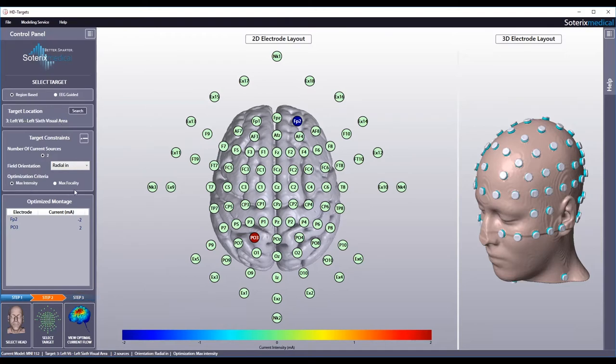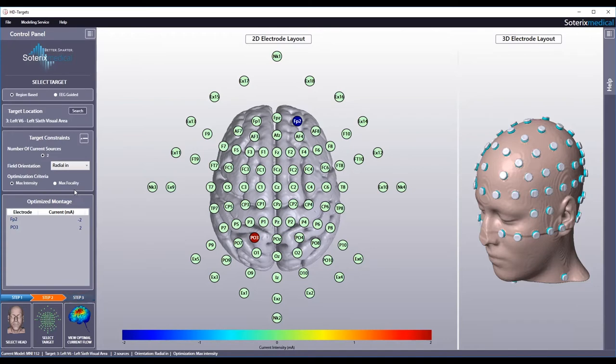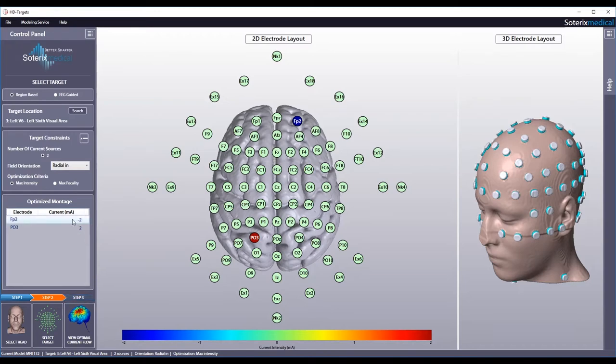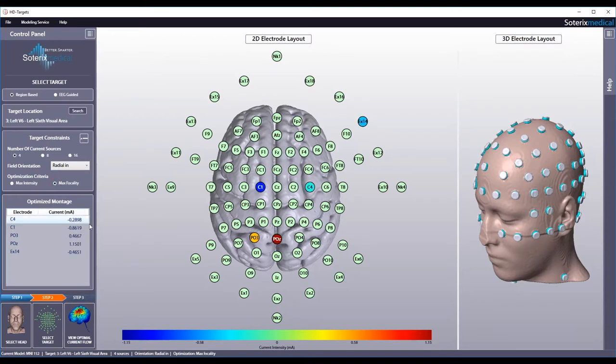You may choose to select maximum intensity, which delivers the maximum electric field to the desired brain target with the limitation of 2mA. As you can see, this allows you to only do two current sources as this is the optimum setup to do maximum intensity. You may also select maximum focality, which delivers the maximum current intensity to the target while sparing the remaining brain regions. Let's go with maximum focality.